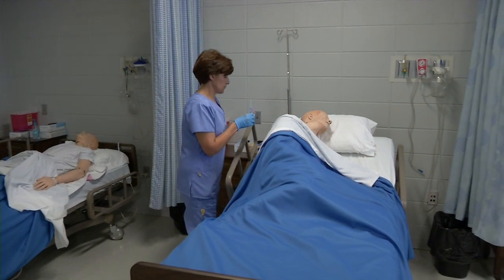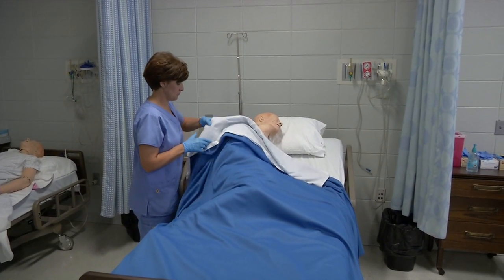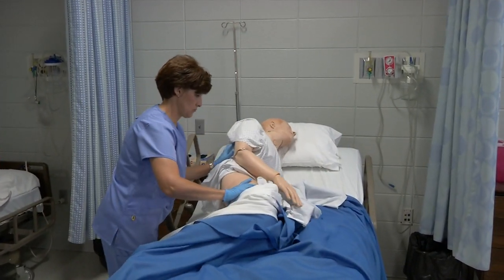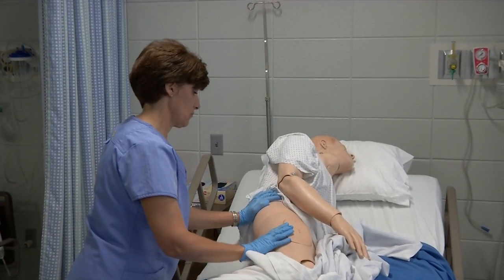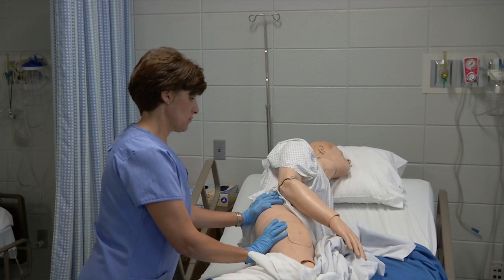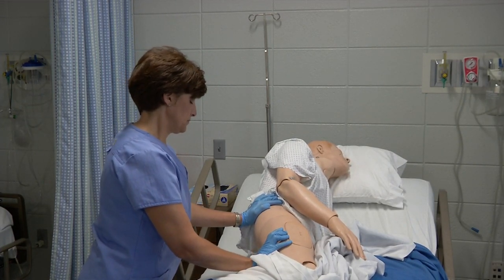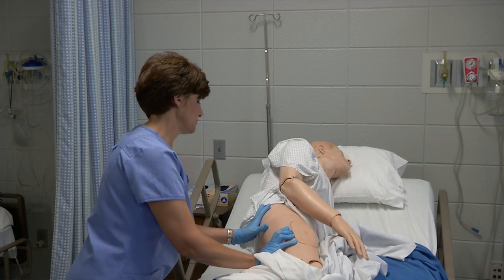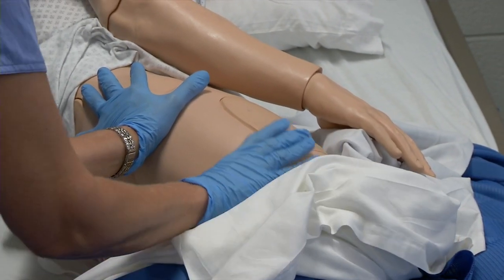You will be locating the 3 IM injection sites. The first one will be the ventrogluteal. The ventrogluteal is recommended with medications that are greater than 2 milliliters. You will locate the ventrogluteal muscle by positioning the patient in a supine or lateral position. Flexing the knee and hip helps to relax the muscle.